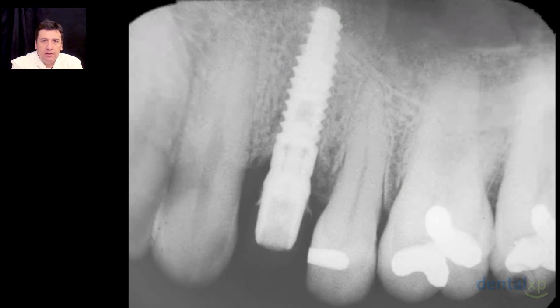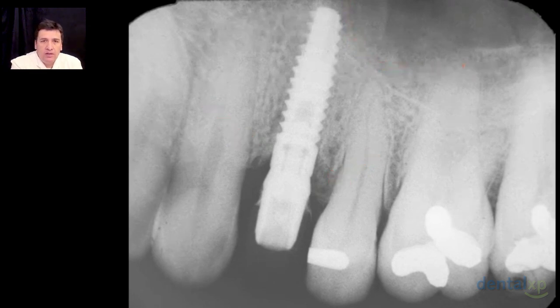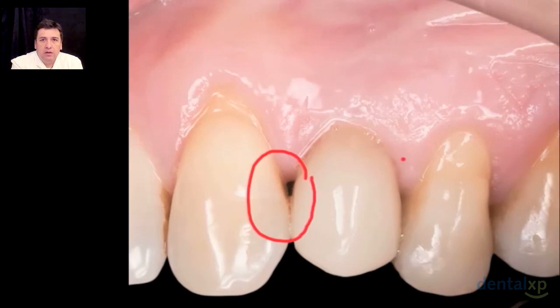This is the image of our implant with enough bone surrounding it, with good bone in the mesial and distal aspects, and also prevented from being filled or falling into the sinus. Also, it's very important that the crown material for filling is out of the gingival spaces. As we are seeing here, that is quite a good image after 1 month, and this little black triangle is reducing every day more. Now we can feel very satisfied about our treatment and the way that we did it.